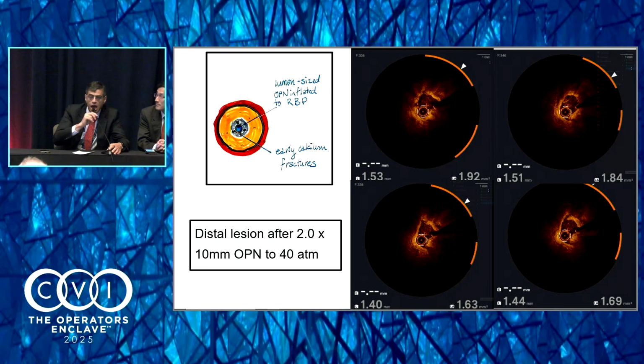That's a beautiful image. How many of you image after you do OPN or other calcium modification to see the fractures? How many of you actually do this on a regular basis? So a minority of people, right?